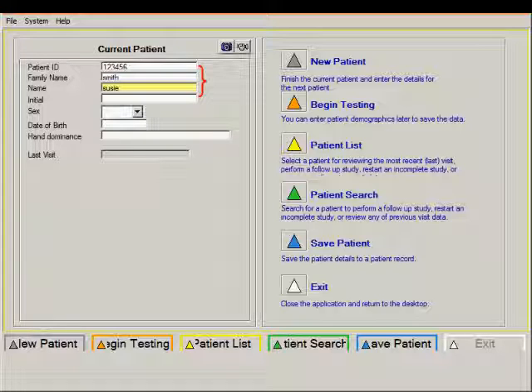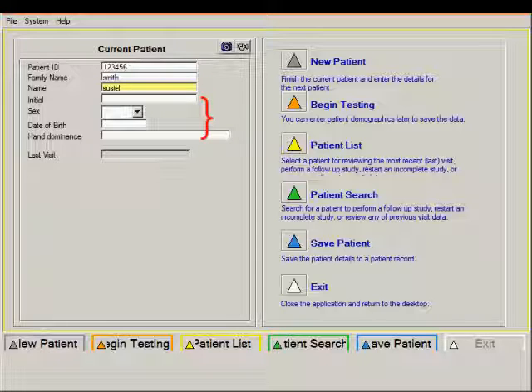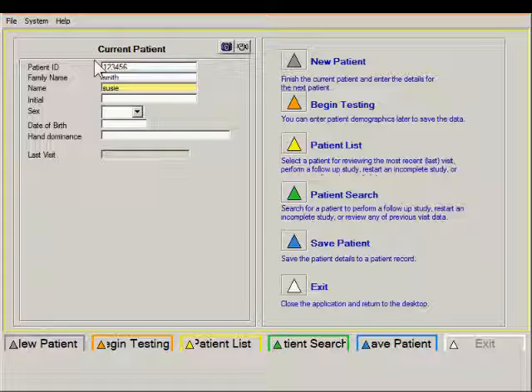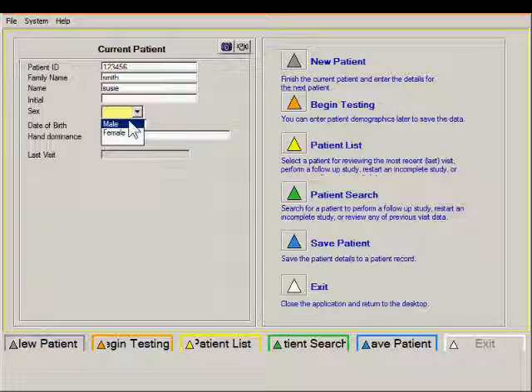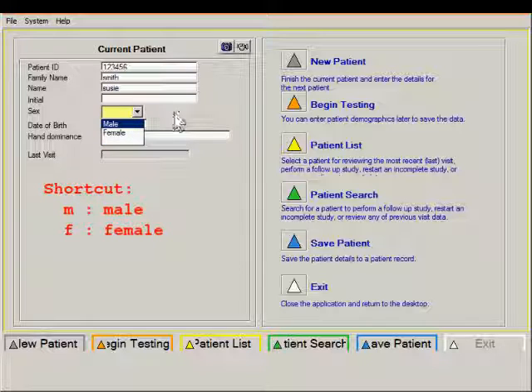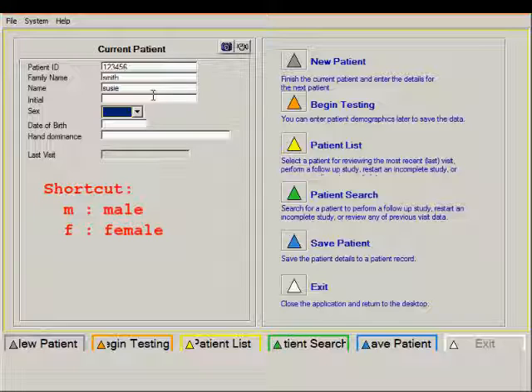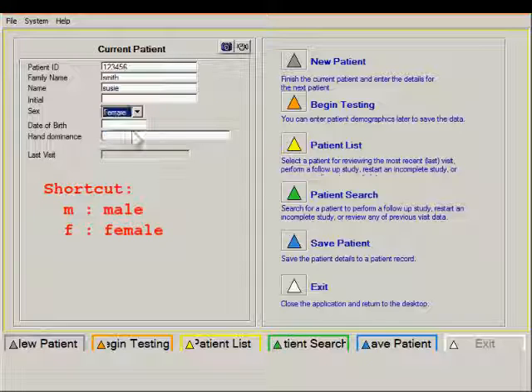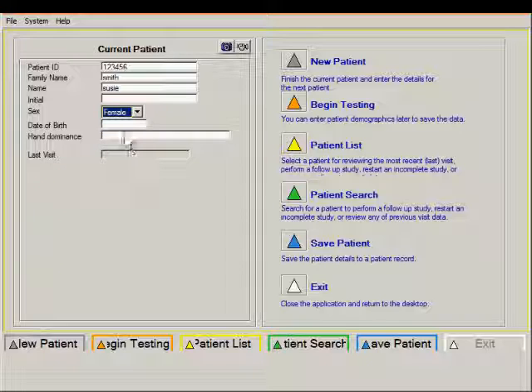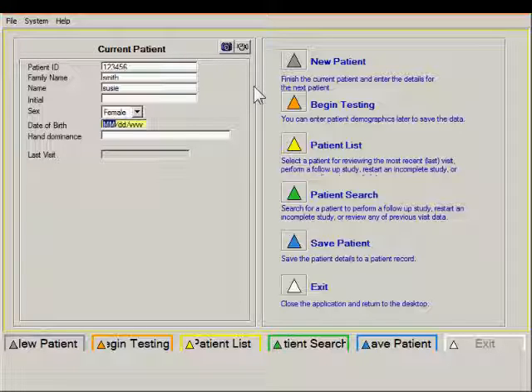Now this is the minimum required information. Everything else that you see pop up on the screen once the first name is entered is optional. At this point you can put in a middle initial or you can select the sex of the patient either by clicking the pull-down menu and selecting from that or typing either M or F for that particular cell. Entering the patient's birth date has to be done in two digits for the month and day and four digits for the year.